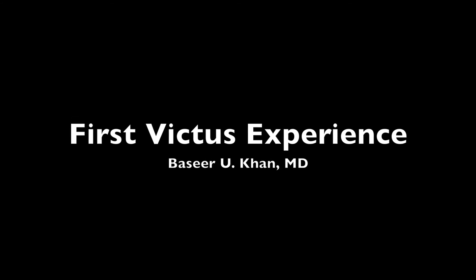Our practice recently acquired a Victus femtosecond platform for the purpose of doing femtosecond-assisted cataract surgery. This video goes over one of the first few cases that we did using the capsulotomy and fragmentation algorithms. This video is completely unedited.